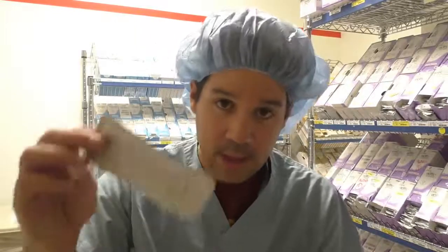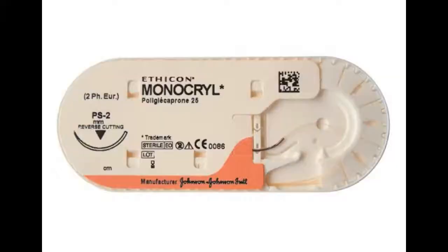General. Last monofilament I want to share with you guys is the Monocryl, another one of the most common sutures used in the OR. So Vicryl is one of the most common multifilament sutures. Monocryl, I want to say, is the most common monofilament suture that you will see used in the OR. It has the orange packaging. Inside itself, it's actually like a clear monofilament suture, interestingly enough.